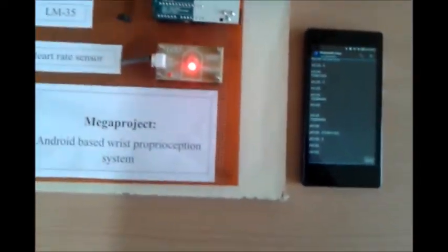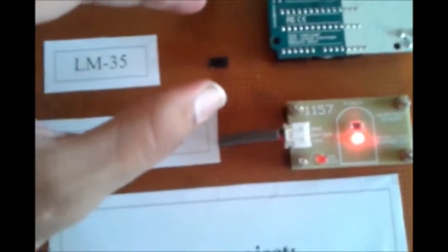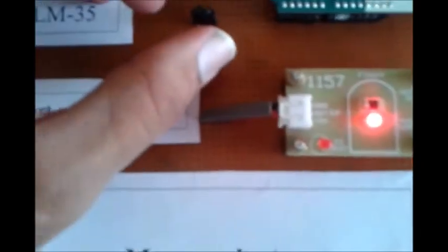Okay, so let us check whether it works if I change the temperature. Let me connect the device first with HC05. Okay, the connection has been established. Now I am putting my finger on the LM35 and we can see the temperature is increasing. It has increased to 33 from 32. 32 was the earlier temperature. For now it is showing 32, 33, 33 and a continuous output of 33.